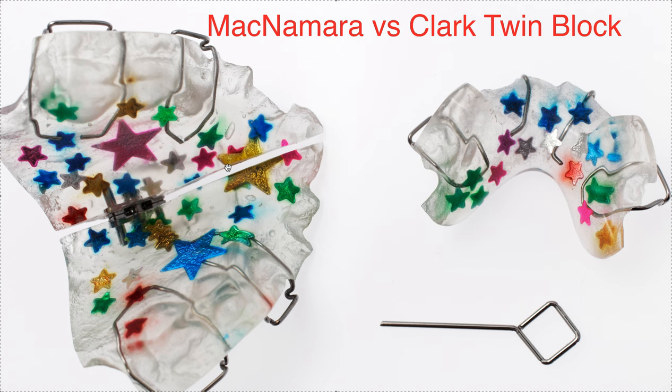I found out that Specialty Appliances calls it something different, so we were ordering the wrong things, because I was telling doctors to order McNamara twin blocks because they had a screw in it — but that's what Dynaflex calls it and some other labs. According to Specialty Appliances, a McNamara twin block is one that has a labial bow with acrylic for more retention, as well as additional clasps in the back for retention.